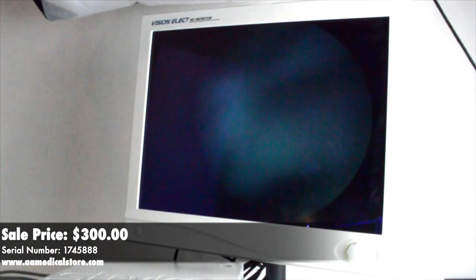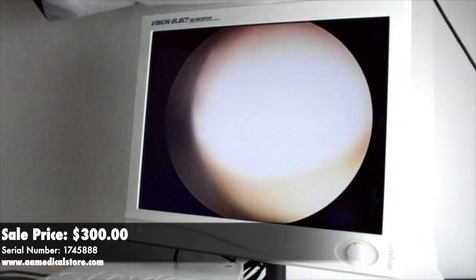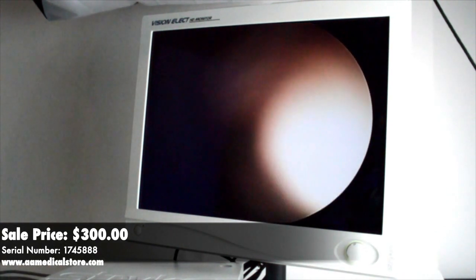So I've got the Karl Storz 4mm 30-degree arthroscope hooked up to the camera. You can see the real problem with this scope seems to be it's definitely a little dark and a lot blurry.